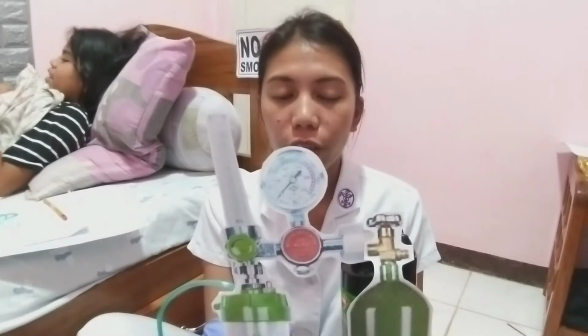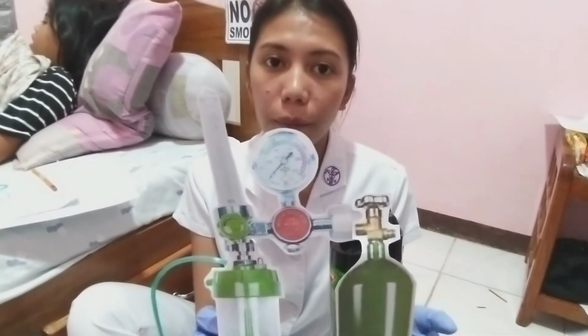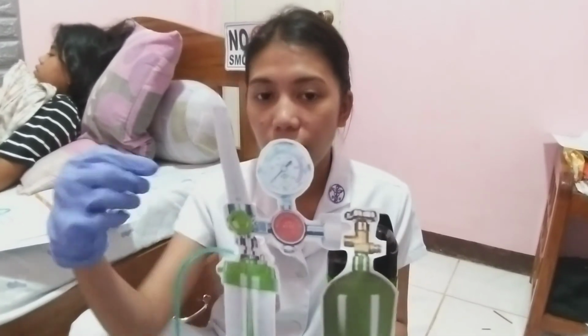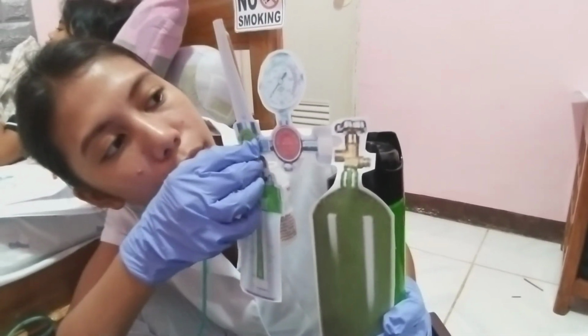Now we are going to set the oxygen at the prescribed flow rate. The patient was ordered to have 2 liters per minute with a 26% oxygen concentration with a continuous duration. So I will set the flow meter to 2 liters per minute.